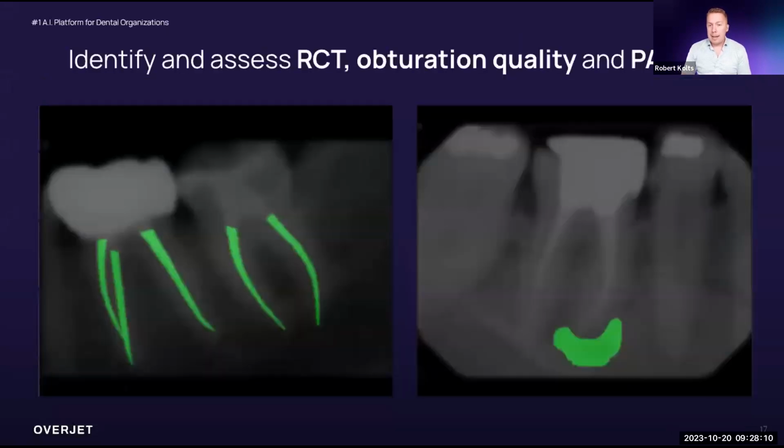We also have models that can detect periapical radiolucencies, that can detect root canal obturations.